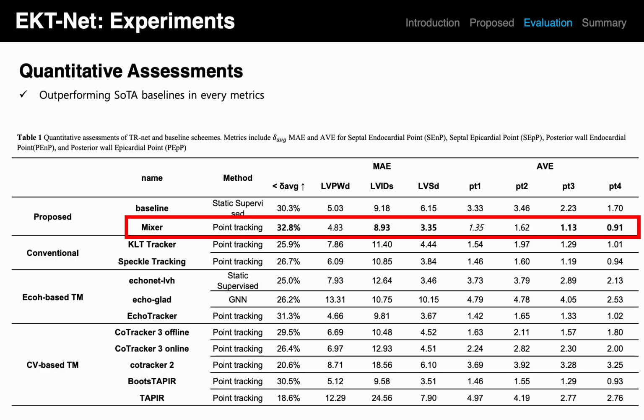Now let's interpret the quantitative results. We compared our method with several existing learning-based approaches and conventional tracking methods. The proposed network consistently outperforms all of them across evaluation metrics. Interestingly, some general computer vision trackers achieve reasonable average distance scores. However, they struggle with biomarker MAE and temporal stability.